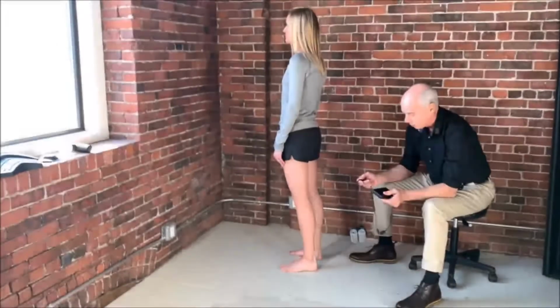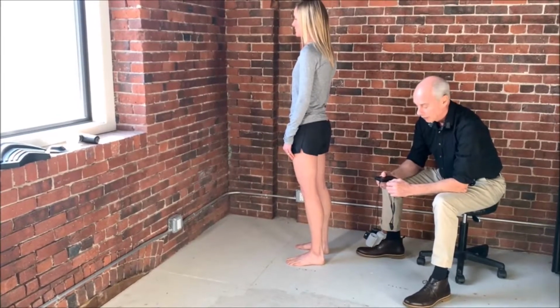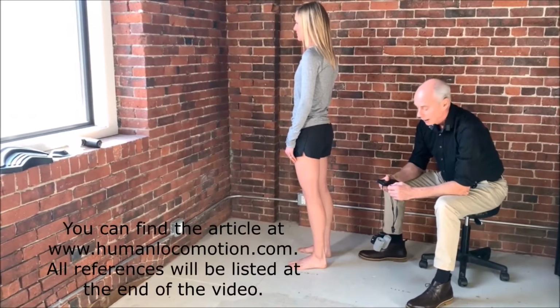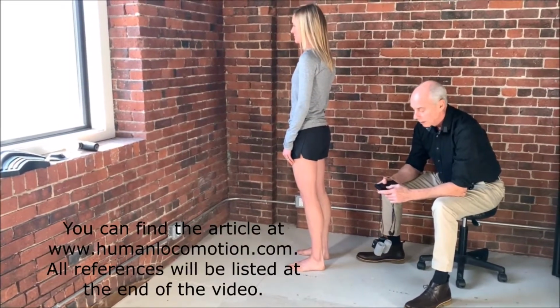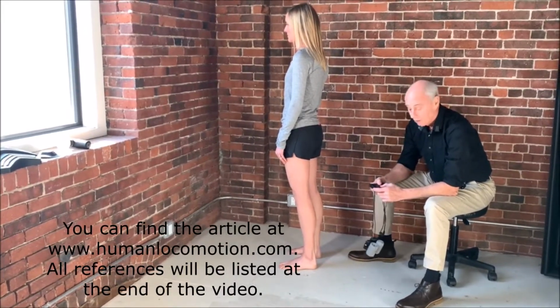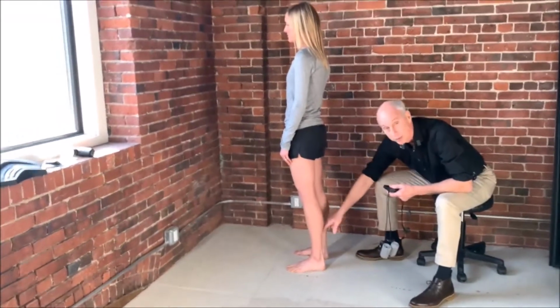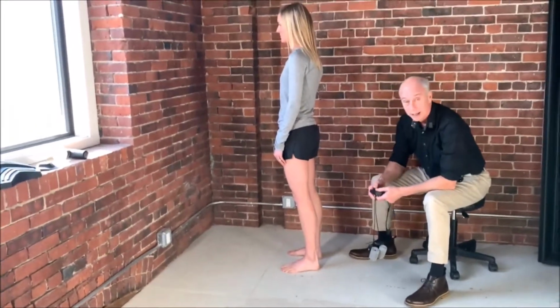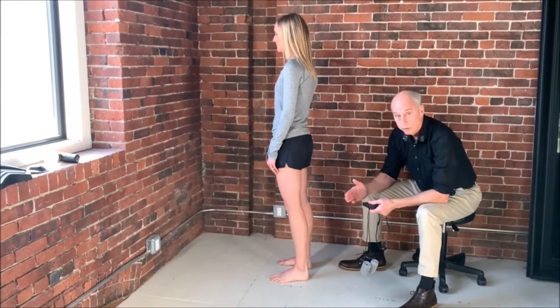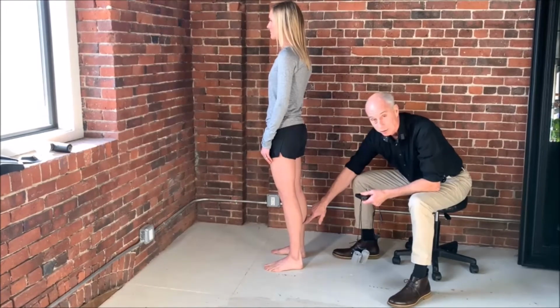So this is one of my favorite diagnostic tools. It's called focal muscle vibration. I've written a couple of articles on it, and it comes from research from Belgium, where these really bright people figured out that if you oscillate a muscle at a very specific frequency, 60 cycles per second, with 0.5 millimeters displacement, you temporarily suppress information from muscle spindles.